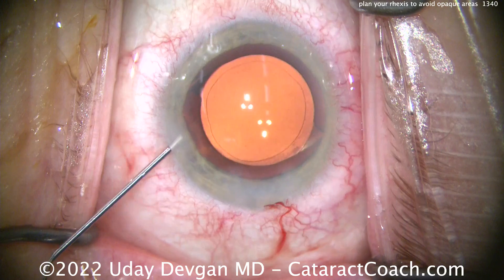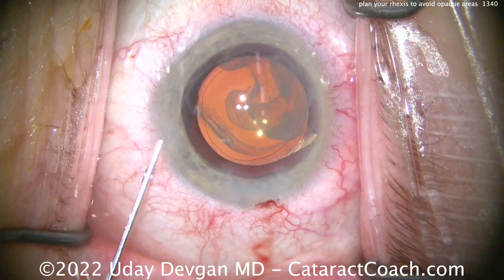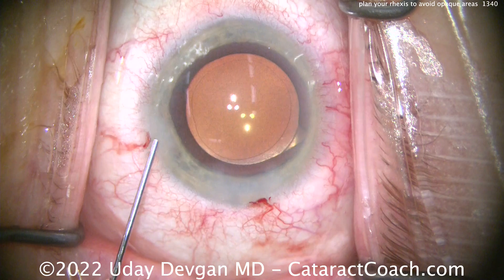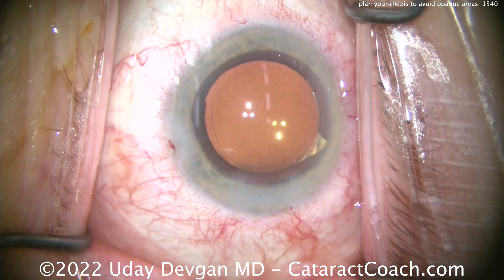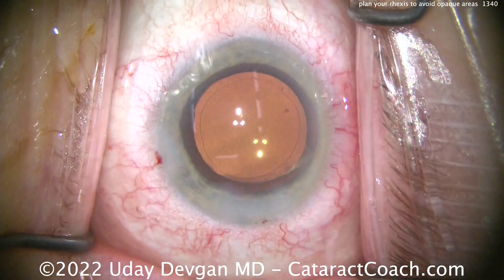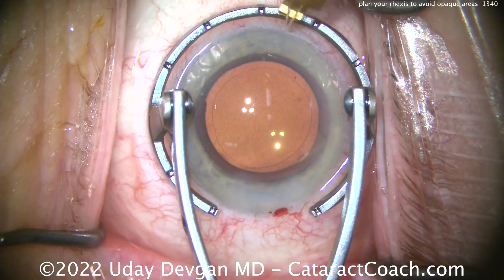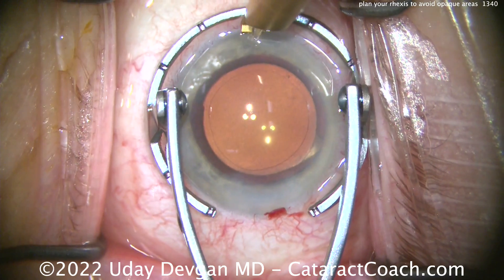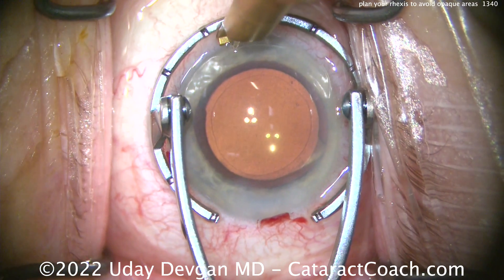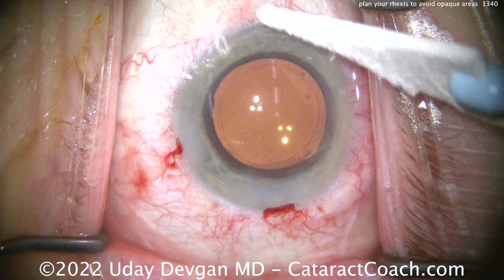Finally, it looks like we're going to put some Triamcinolone in the AC — that is preservative-free Triamcinolone. Cataract Coach has a video showing how to get the regular $4 or $6 vial of Triamcinolone and remove the preservatives; use the search function at CataractCoach.com. Just a tiny amount here — it's going to give the eye a nice break from inflammation for a quiet eye tomorrow. Here's a small limbal relaxing incision placed opposite the main phaco incision, which should treat about half a diopter of astigmatism. Let's check everything — that looks great.